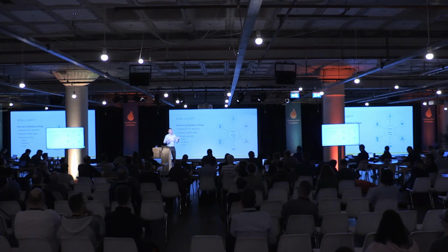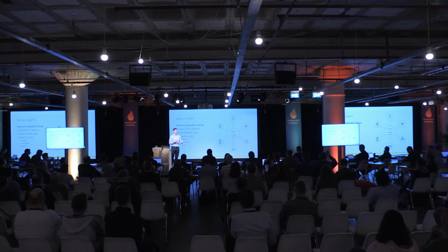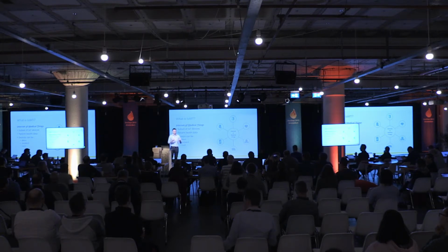And they can run a gamut of different shapes and sizes. Some of them are worn, like the two I have on me today. There's other types of sensors that are ambient, so they live in the environment. So as people walk by, they can take some biometric readings like heart rate, respiratory rate, stress levels, and things like that. And then there's classes that are used. So you can have injectables or inhalers, like asthma inhalers or insulin pens and things like that.